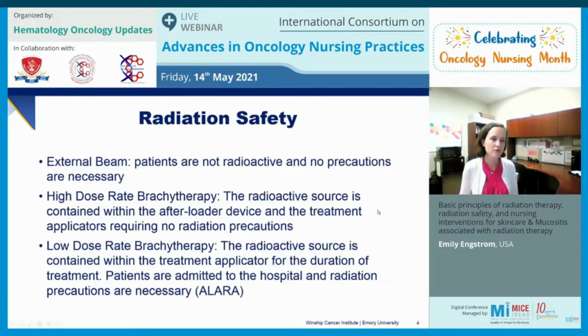So, as far as radiation safety goes, this has really changed over the last 22 years that I've been in radiation. External beam has always been very similar to the X-ray radiology departments. When the LINAC accelerator is on, that's when the radiation is being delivered and emitted. We are not in the room with those patients so as to avoid any dose of radiation to the staff. But those patients are not radioactive. There are no precautions necessary once they walk out of that room each day. There's no issue with radioactivity.